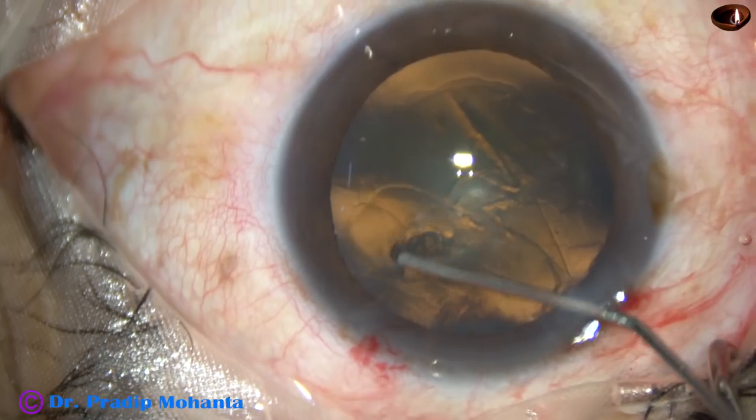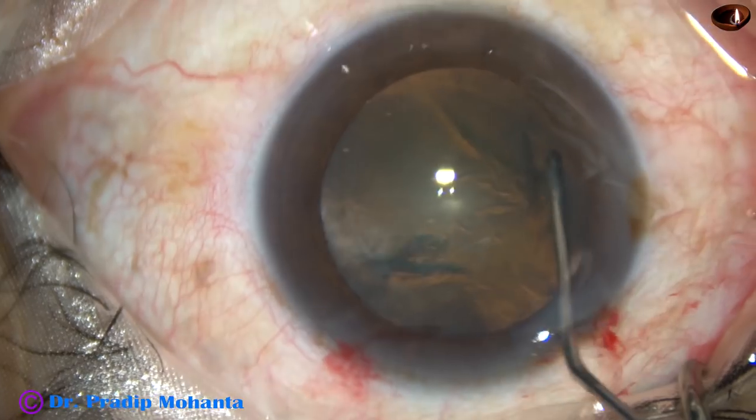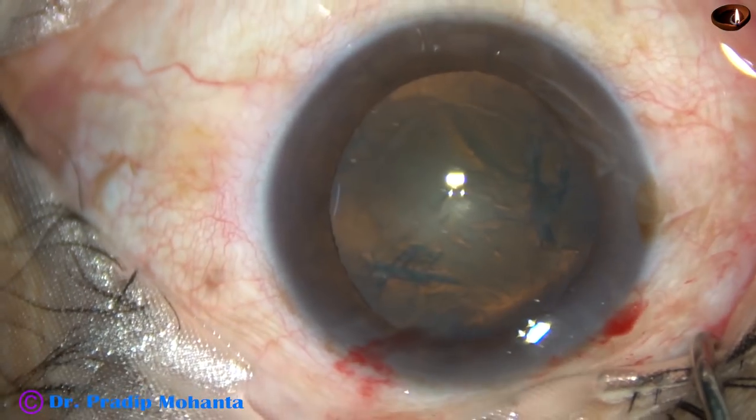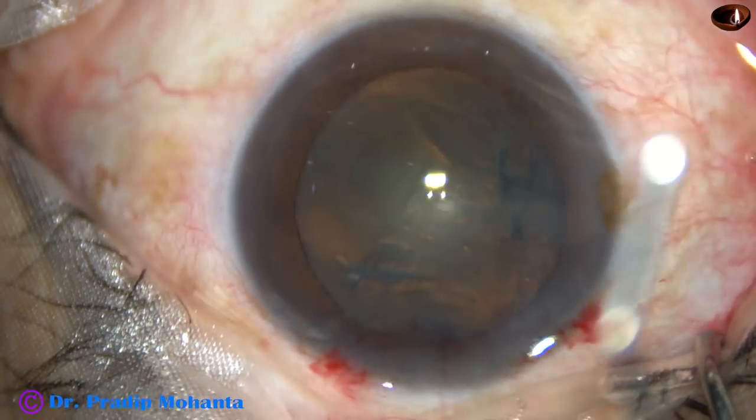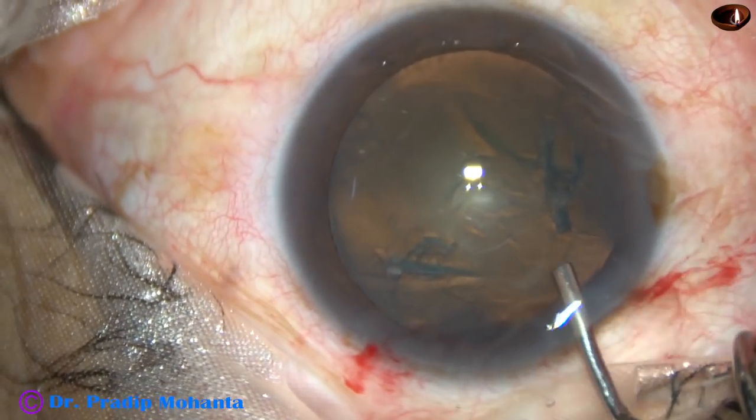Now, hydrodissection. The fluid wave has gone to the opposite equator. Depressed the nucleus and the fluid wave comes anteriorly, indicating complete hydrodissection.